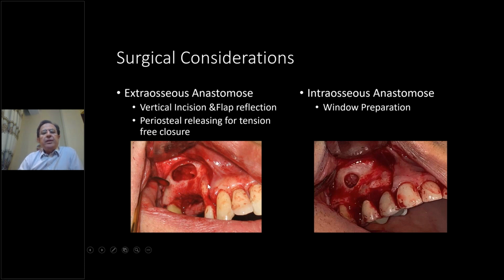The releasing incision is mostly done in the mesial part between the canine and premolar. If we pass the mucogingival junction, it's better not to extend much. And after passing the mucogingival junction, it's better to push this area with a blunt scissor or a blunt instrument to have more access to the area.